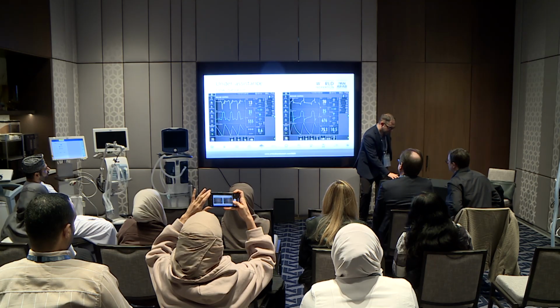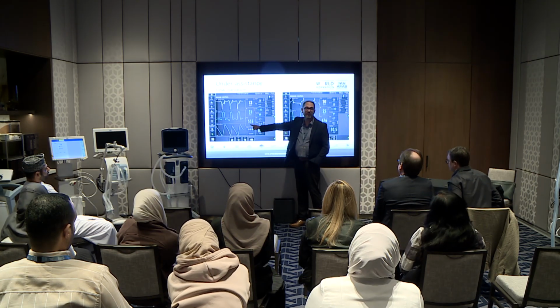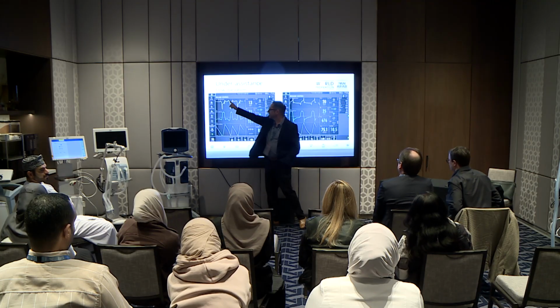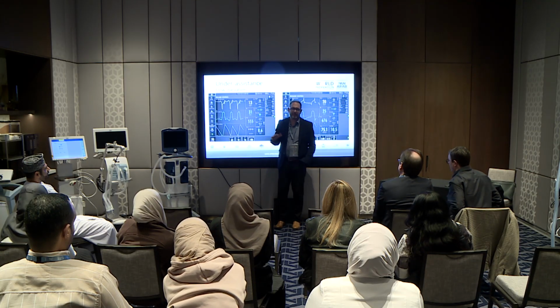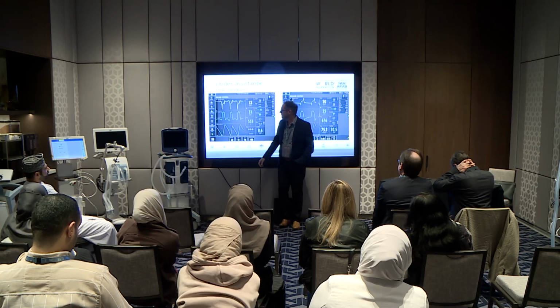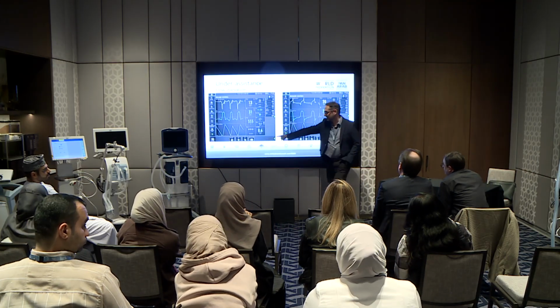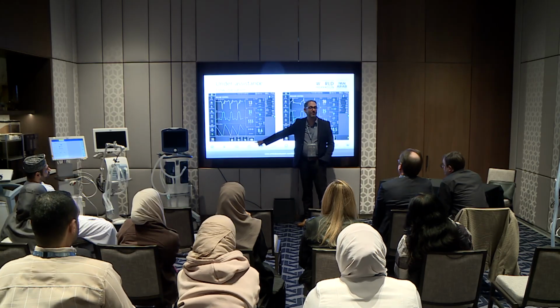So on here, she's on volume control of 400 mils. But she's pulling 500 from the ventilator, and look, the ventilator's not doing anything. She's just pulling volume out of the ventilator. So usually we need to keep low tidal volume for the ARDS, so, well, we try. I'm saying sometimes you can't do it.